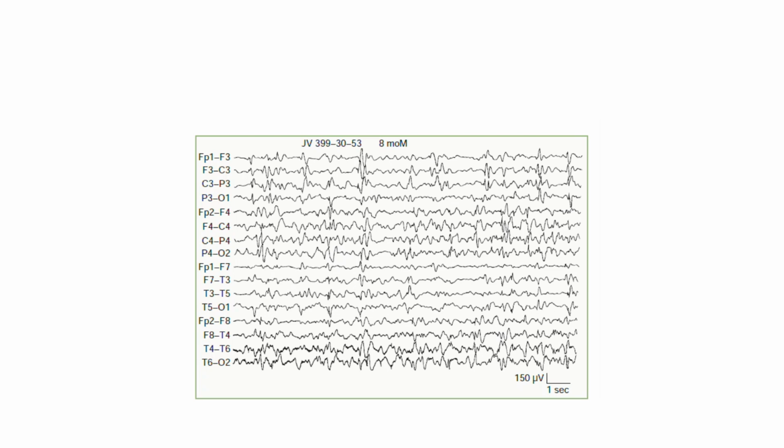2. Clinical significance, West syndrome. Hypsarrhythmia is the pathognomonic EEG hallmark of West syndrome, a severe, age-specific epilepsy syndrome of infancy. It classically presents as a triad: hypsarrhythmia on EEG.